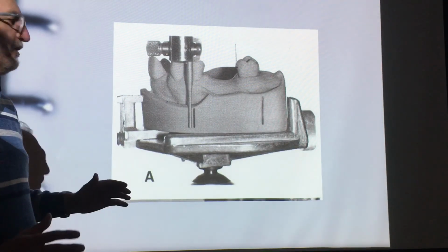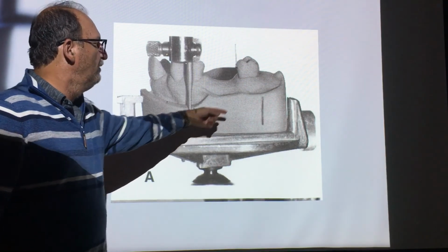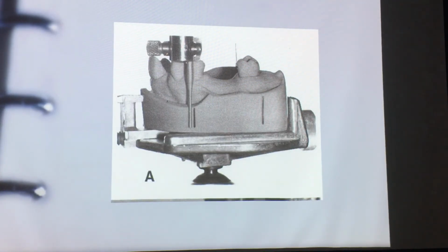Once we've decided on our path of insertion, measured the height of contours, or analyzed the height of contours, that would be useful for our case, we're going to tripodize the cast. This is one way of tripoding. One line and then another line at the base of the model. The purpose of tripoding is to replace the model back to the surveyor at any given time at that angle. That's all it does. Tripoding is just a memory device, so we will be able to put the model back to the surveyor quickly and efficiently at the same angle.